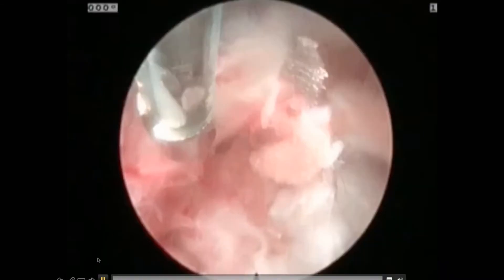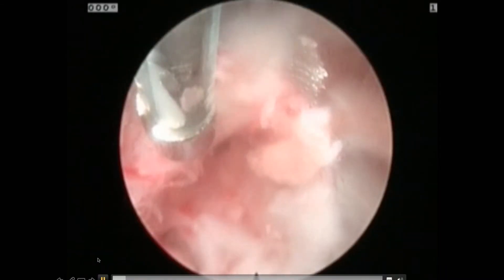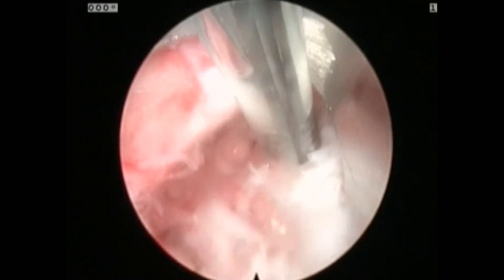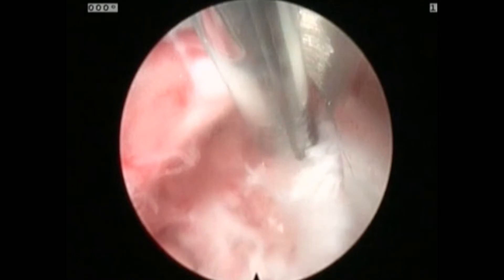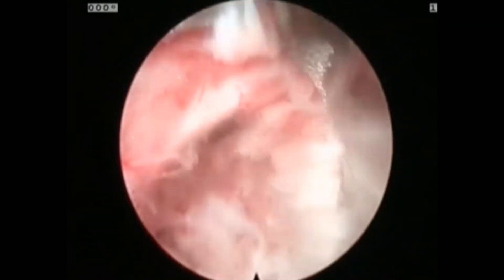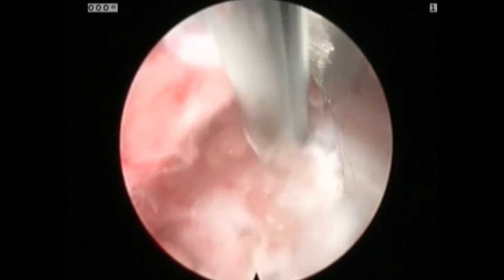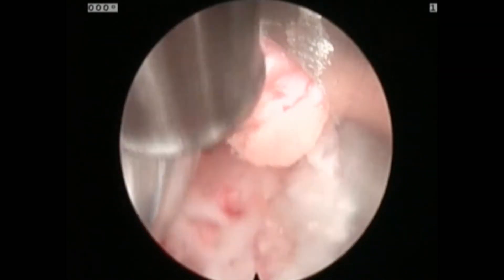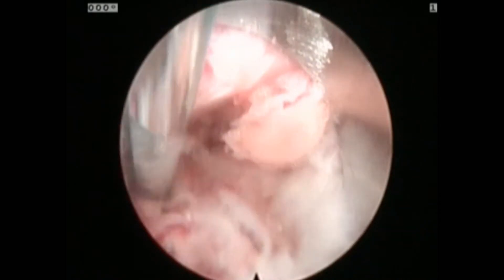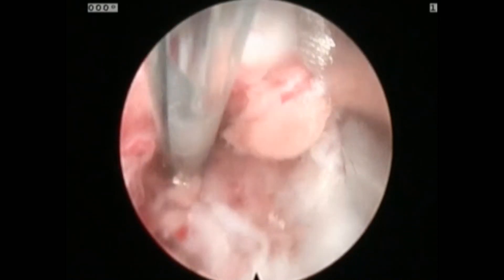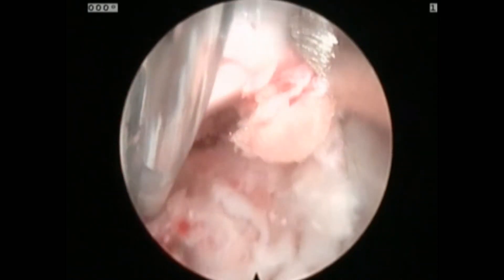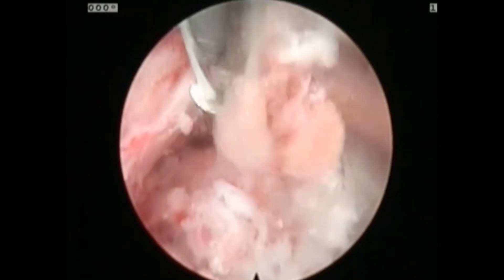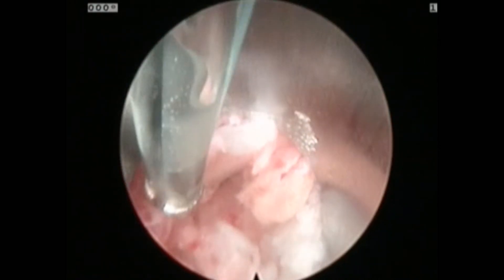This is an exiting L2 nerve root. This is the vertebral body. There's epidural venous bleeding that I am coagulating. I can reach underneath the nerve root. There's an osteophyte that I need to get, but you can see very nicely the nerve root.